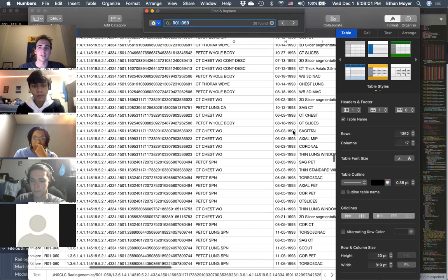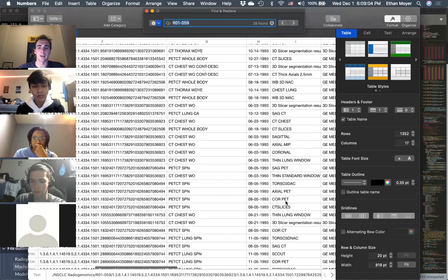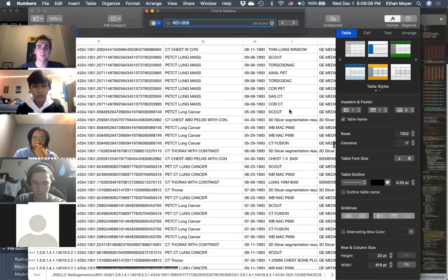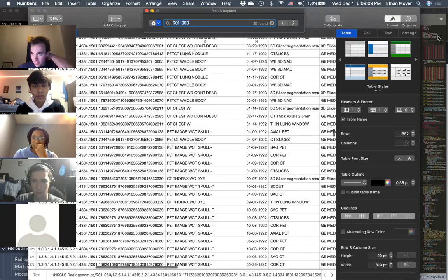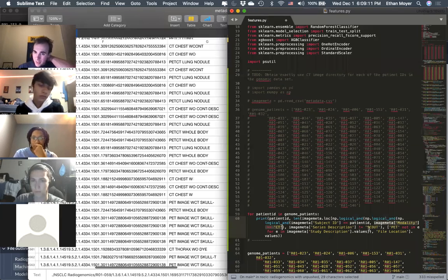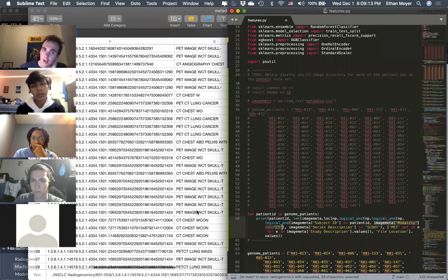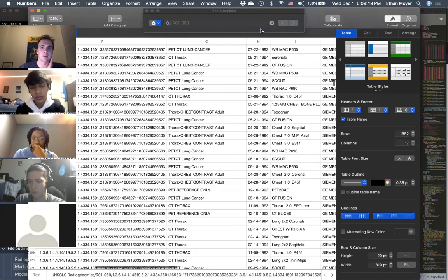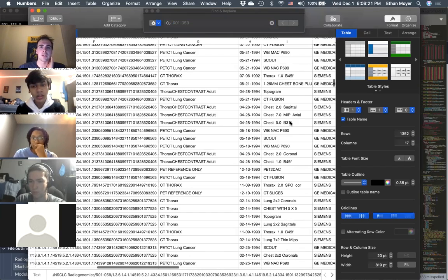But they're of different series. I guess what really matters is this right here, which is the sequence, the series description. But I don't know if that's harmonized because they're pretty different actually. So it doesn't really matter.